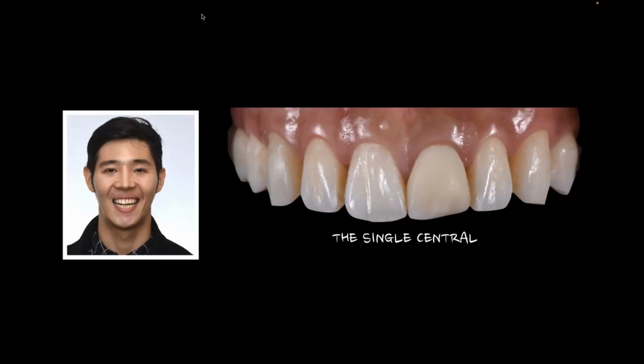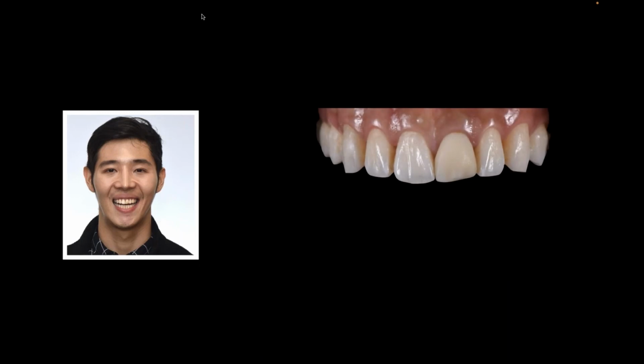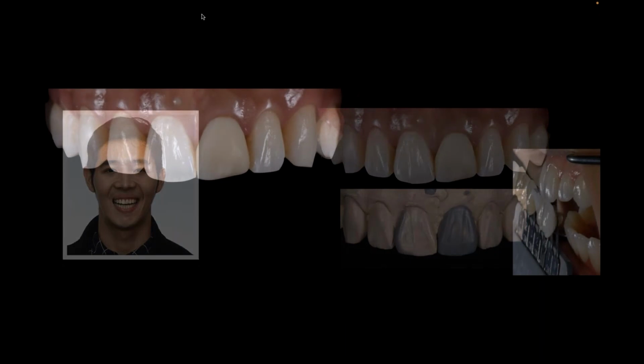This is where it's more challenging, where we're trying to match one tooth. Single centrals, I've showed this case before. Same scenario here when I'm trying to match one tooth to all the other teeth in the patient's mouth. I have to look at everything: the face, the white, the pink, the gingival harmony. In this case, I think I've said before, I actually thought that maybe it would have been smart to do a window veneer on the number 8, only because the space was so big on the number 9. But in the end, we decided not to.